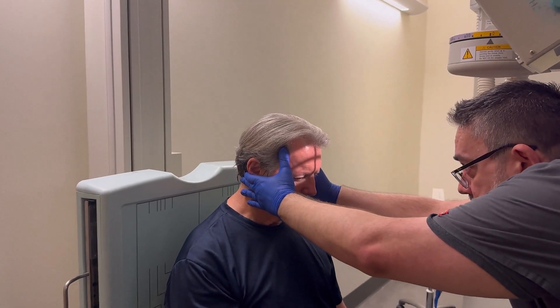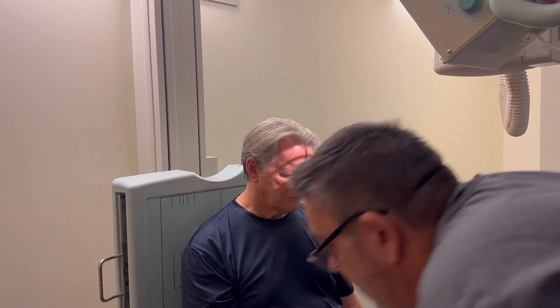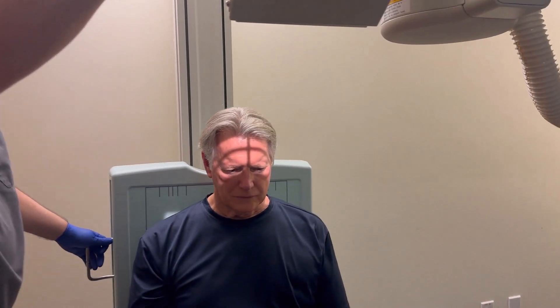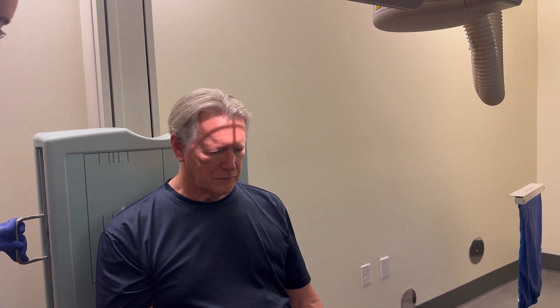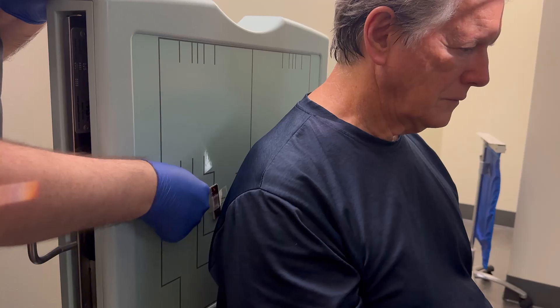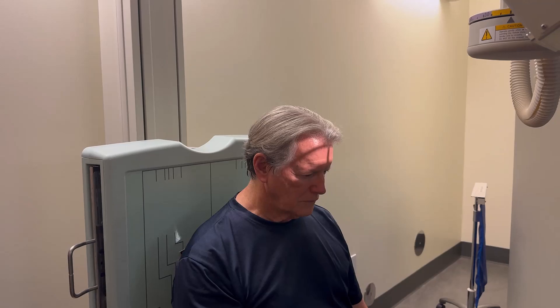I'm going to correct for tilt here — turn this way and slide over just a little. There we go. Then all we need to do is line up our bucky and then recollimate. Notice my marker is outside of where the condyle would be — be really careful, you want to have it towards the edge of your light field. Then take on suspended respiration. Again, you're going to do an open mouth and a closed mouth view.